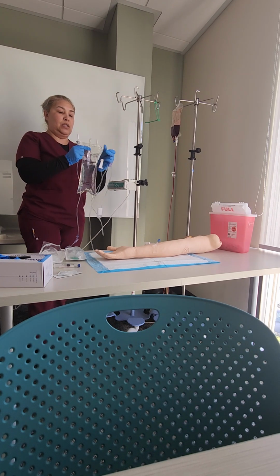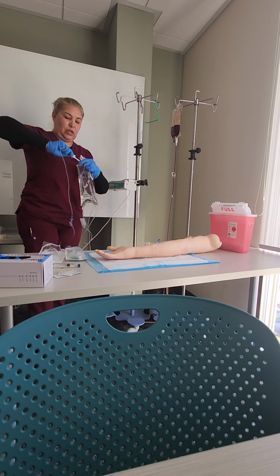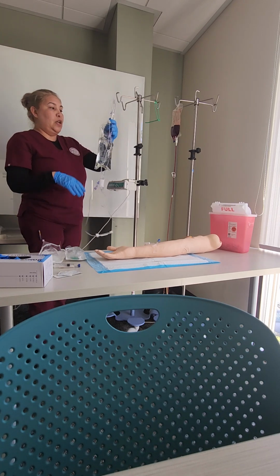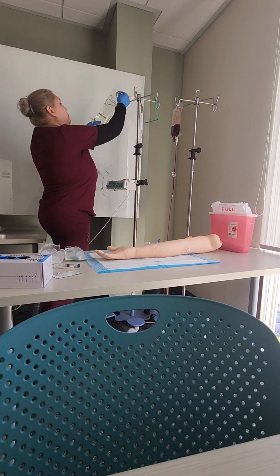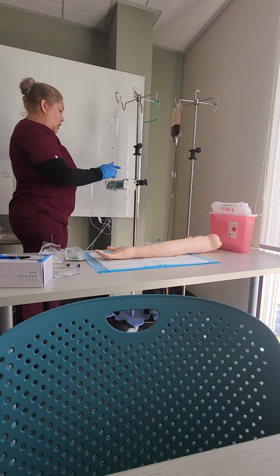I do not want to touch this also because it is sterile. So I want to go ahead and make sure I wiggle this in, and I confirmed that it was clamped, so nothing will be falling down. Perfect. I have hung my first bag.